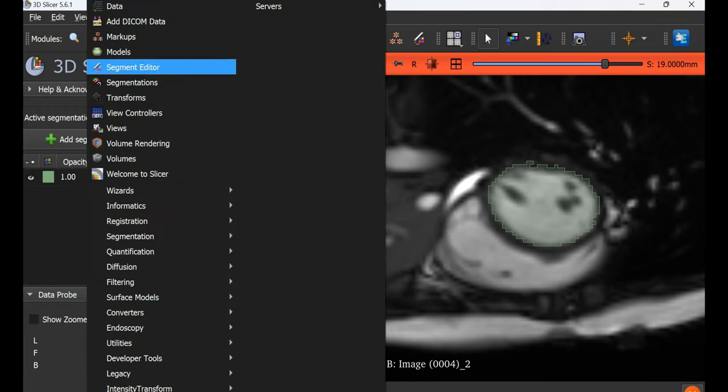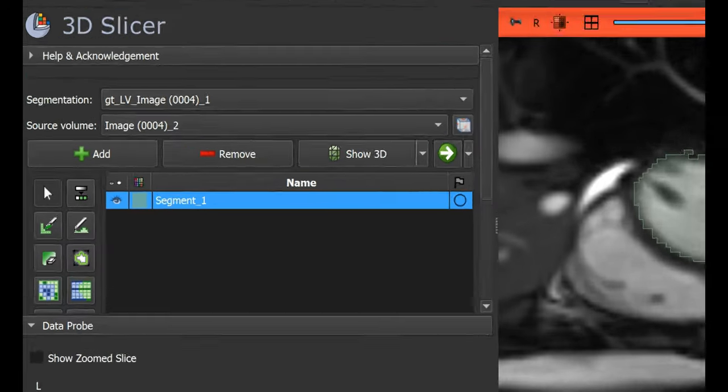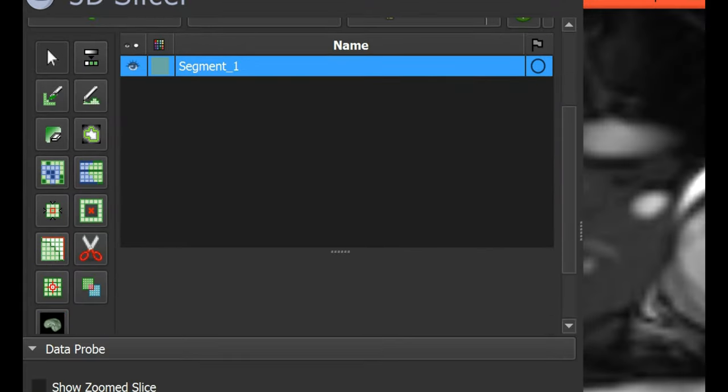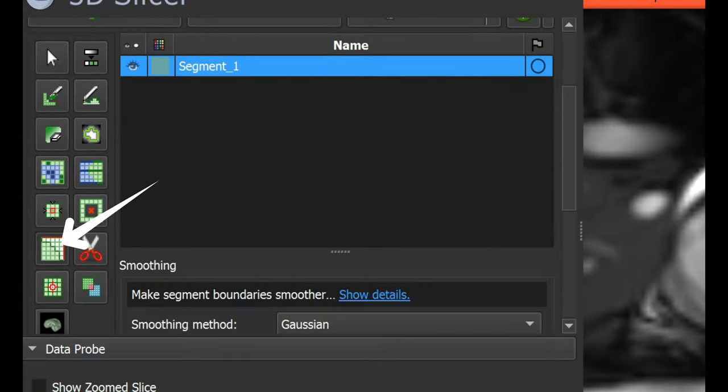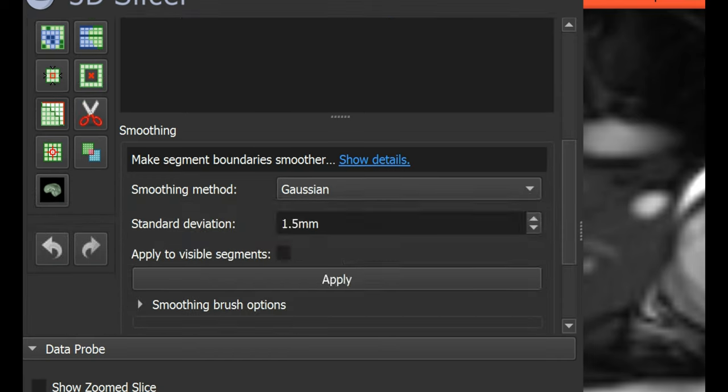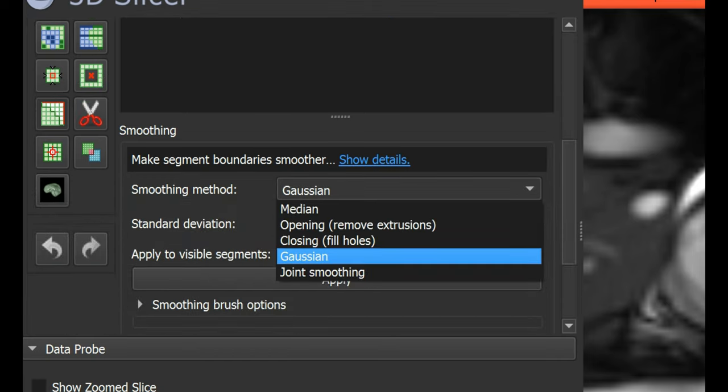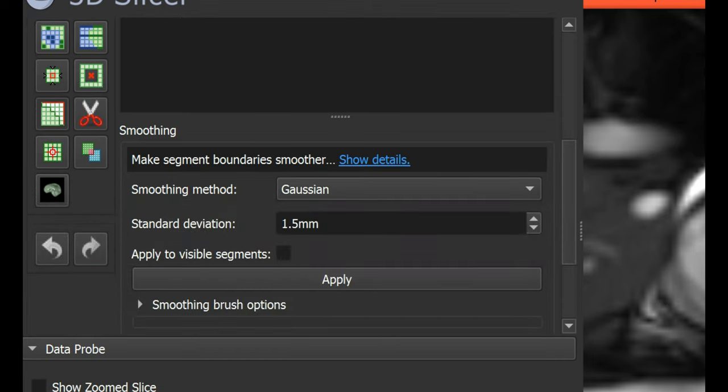Now we can go to the segment editor where we can edit our mask. We have various tools available. First, we'll use the smoothing function. I prefer Gaussian smoothing, but you can choose whichever you like.